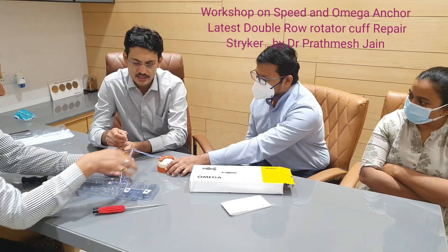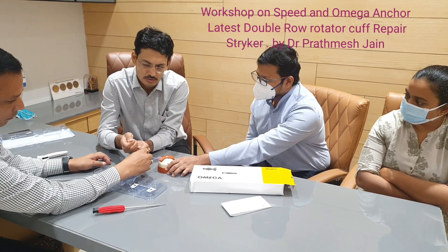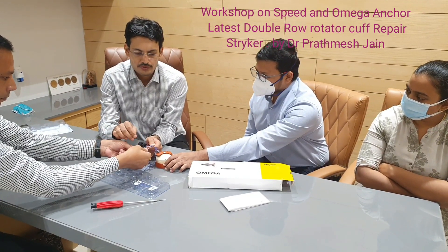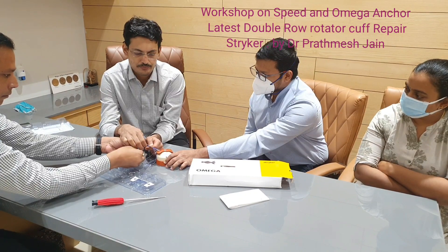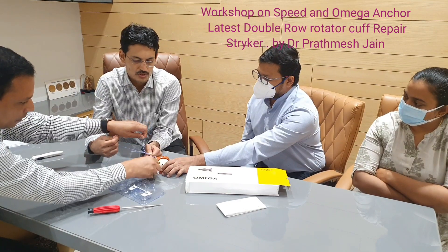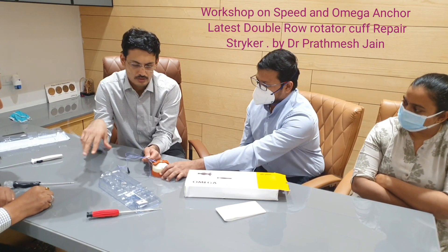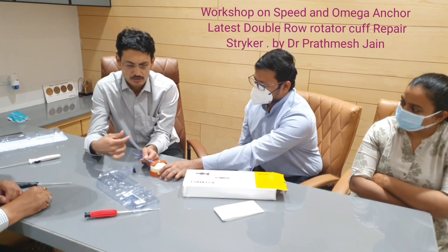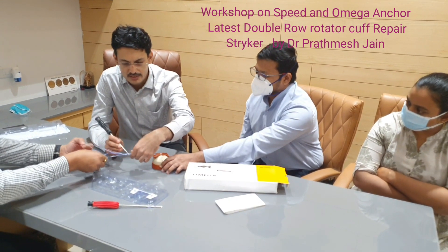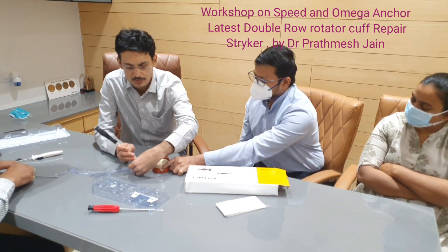All four tapes can be inserted into the wire loop and then taken out through the system. All tapes can be passed nicely through this system. You can see that all four tapes are inserted — it can accept a maximum of six tapes or six sutures.